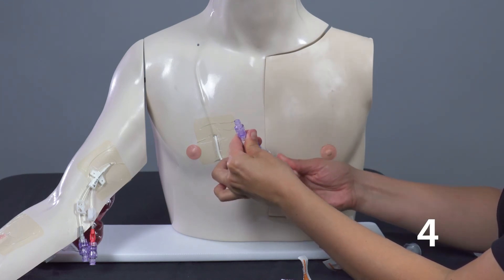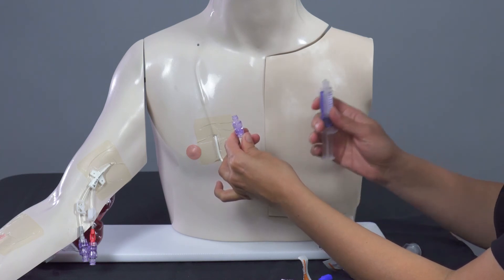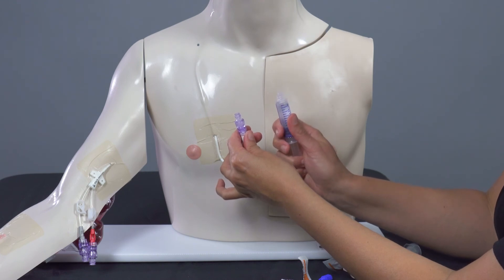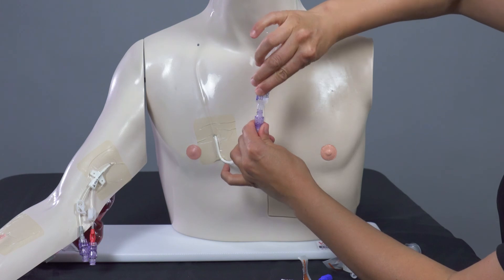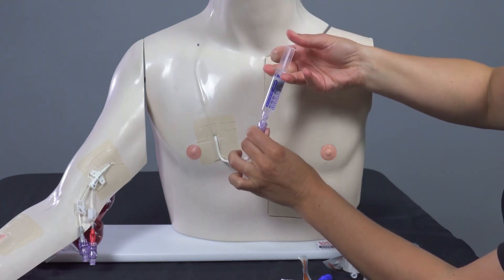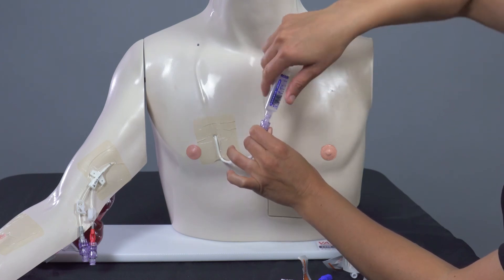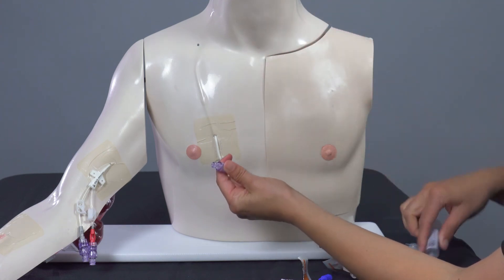Take the cap off of the heparin syringe and push the air bubble out. Push and twist heparin syringe into cap. Pulse flush the amount of heparin that's been specified by your medical team. Holding the clear cap firmly, untwist to disconnect heparin syringe and discard.